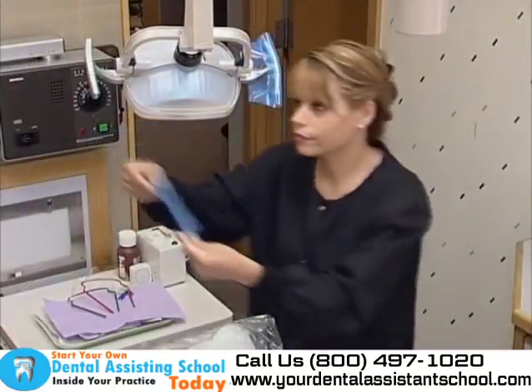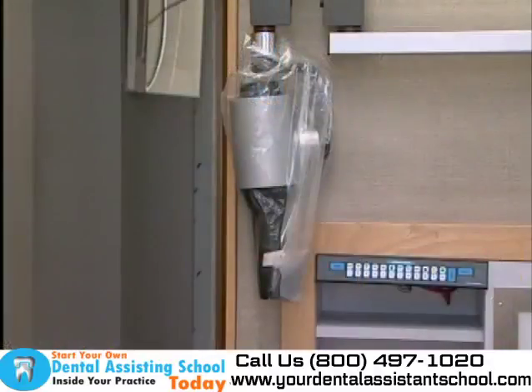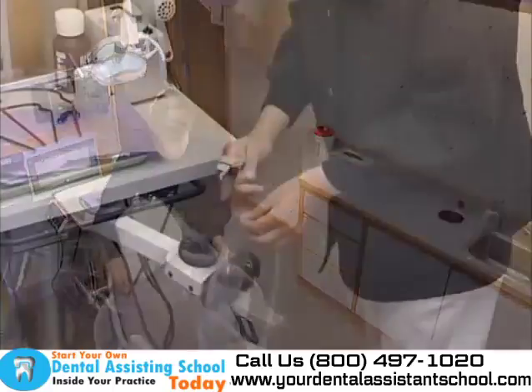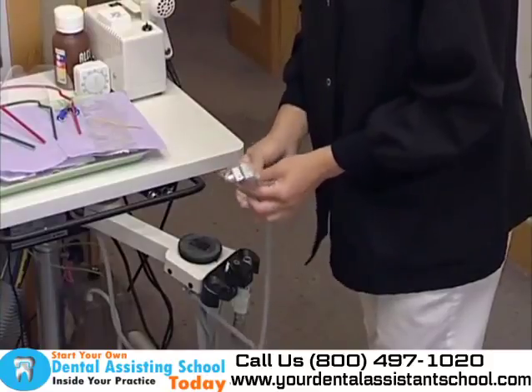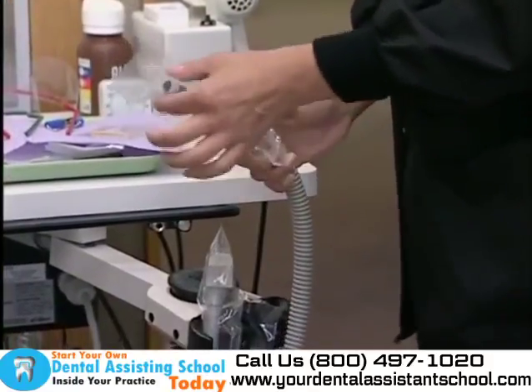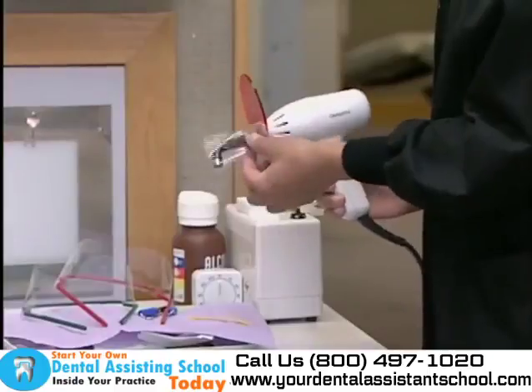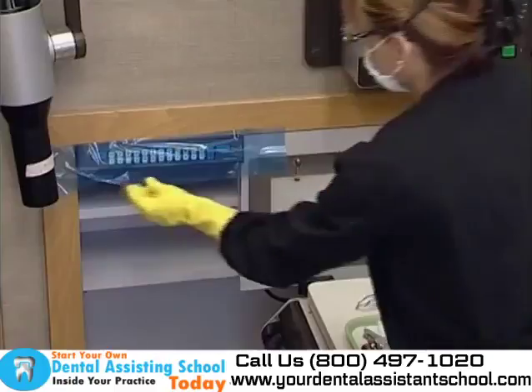Once disinfected, a plastic cover is placed over the light handles, the X-ray head, and the patient chair, including chair controls that will be touched during the procedure. Plastic sleeves are placed over equipment such as the air-water syringe and high-speed evacuator. The plastic acts as a barrier to protect equipment from contamination caused by spatter or spray. This aids in the prevention of disease transmission.